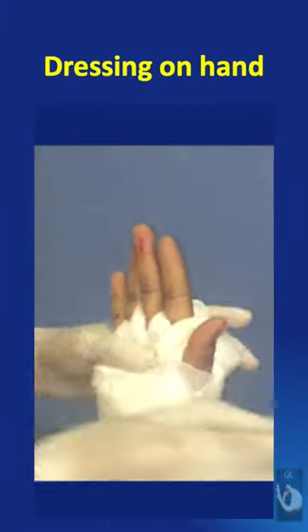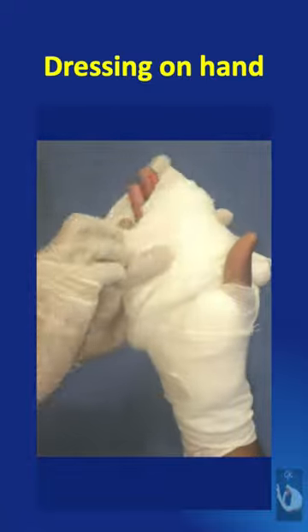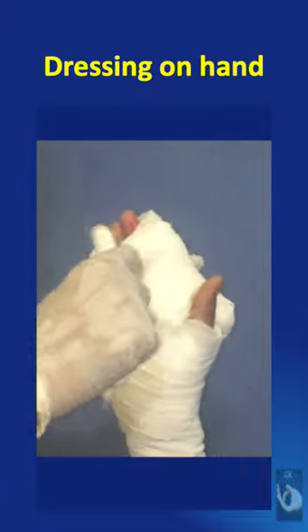A bandage is now applied and secured with a six centimeter length of one inch micro pore plaster. If the wounds are on the fingers also, or the dressing needs to extend to the tip of the fingers, then the pad can be applied around the fingers also, keeping the fingertips exposed.